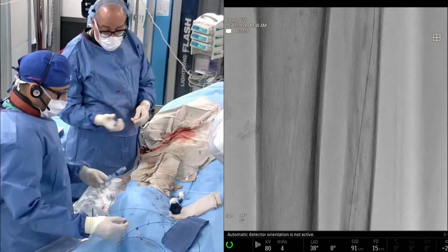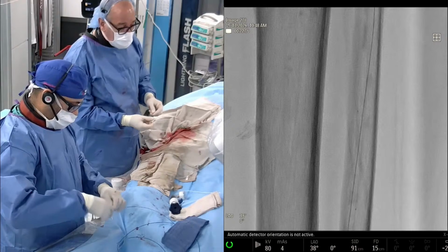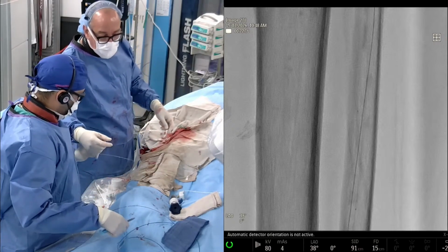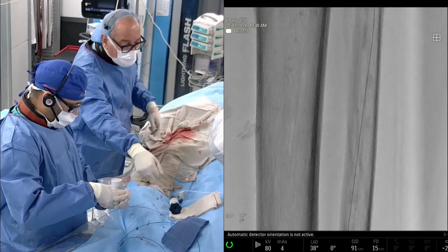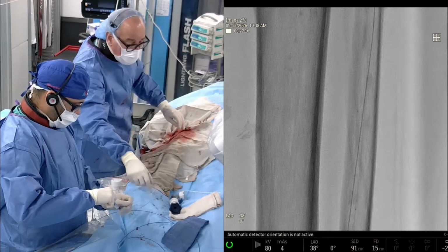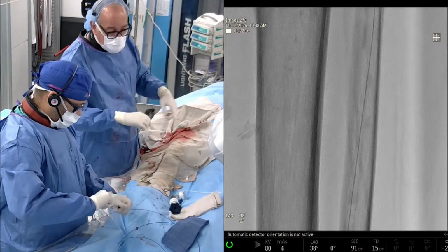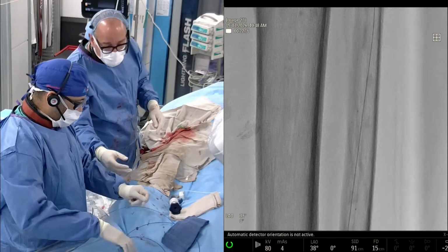We obviously have level 1 evidence for rivaroxaban for PAD in the avoidance of adverse events. Can you just hold this for a second? Thank you. I just want to wipe down the wire so we don't get stuck. But we're discussing this as a group. I think it's a great conversation about whether or not the bleeding risk is going to translate over to a PAD population, and what does that look like, and what does lower dose have to do with it.